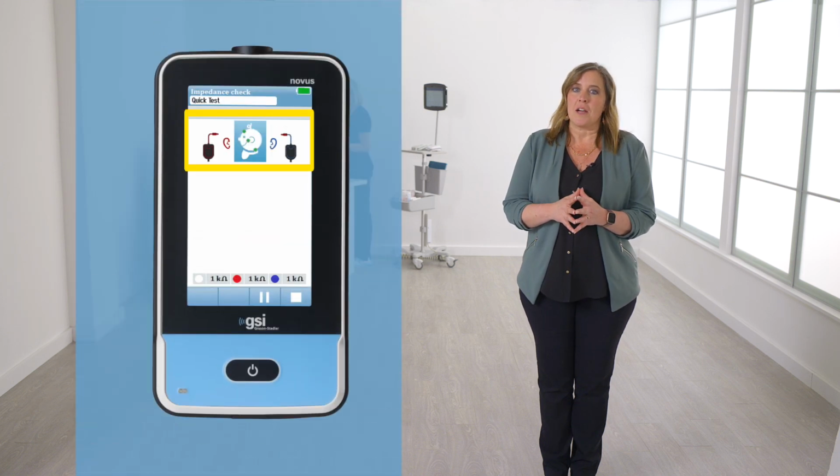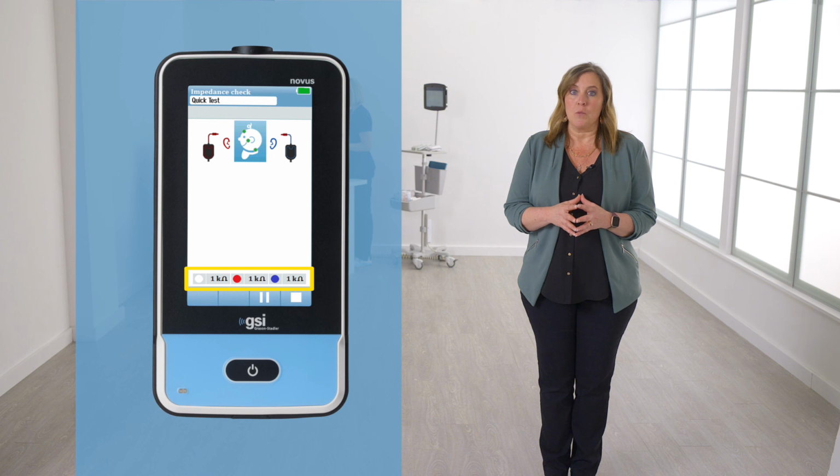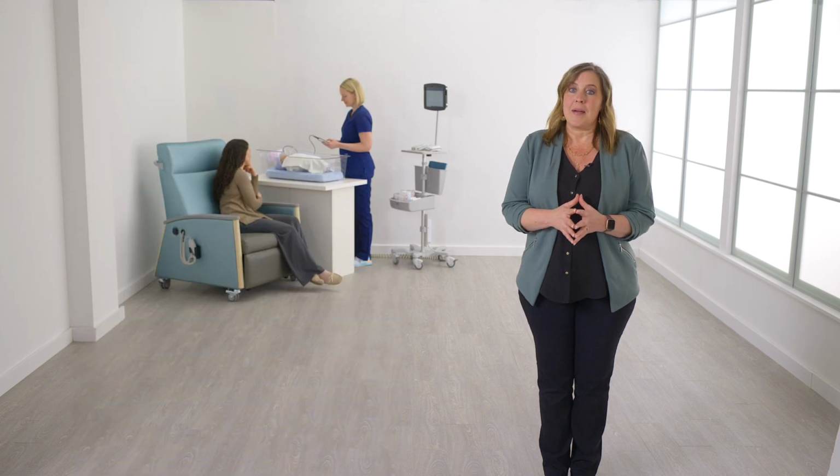There's an illustration with a color-coded dot at each electrode site that will turn orange or green. The numerical values at the bottom of the screen will show the actual impedance value for each electrode. The lower the number, the better the impedance and the faster the test. It is recommended that the impedance value be 10 kiloohms or lower for all 3 electrodes.